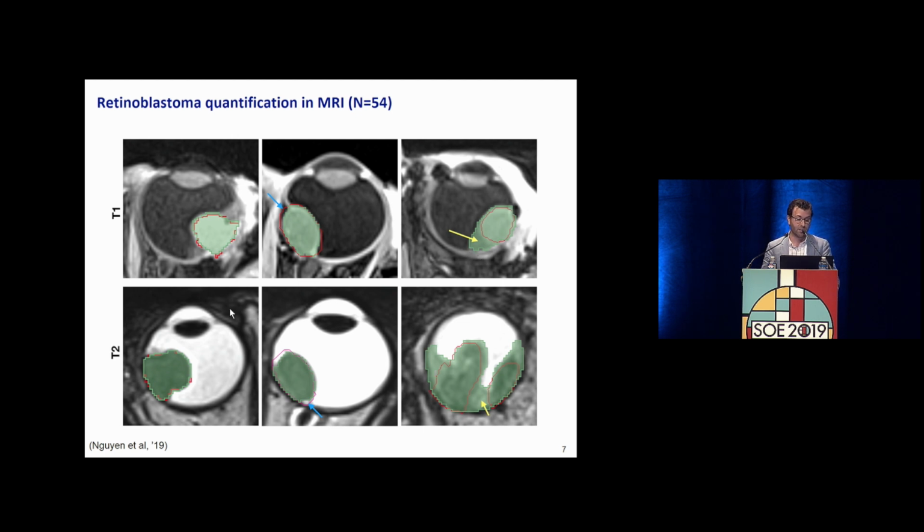In these two cases on the left, they're doing quite well, and on the third column, it's pretty awful. And this quality that we're seeing in the predictions is a consequence of the amount of data that's used to train these deep learning methods. In this case, only around 35 patients were used to train the model, which is relatively few.